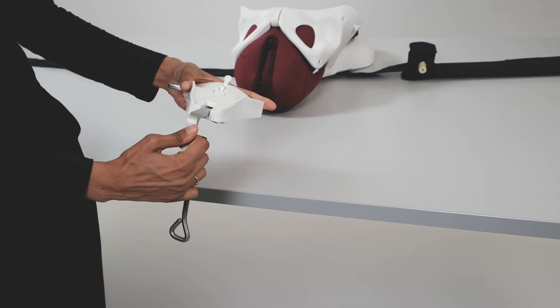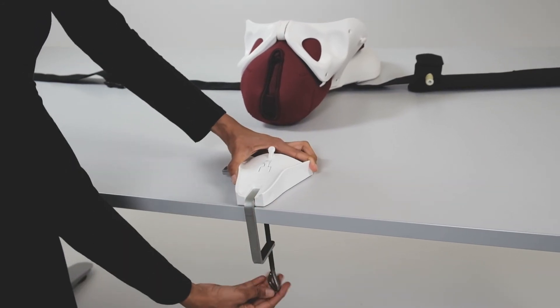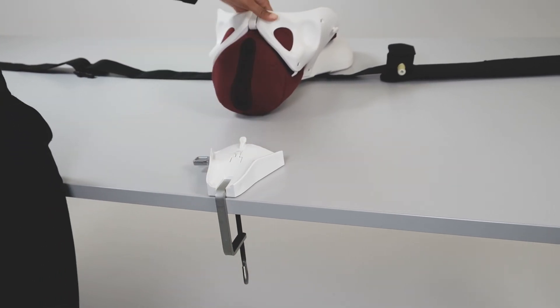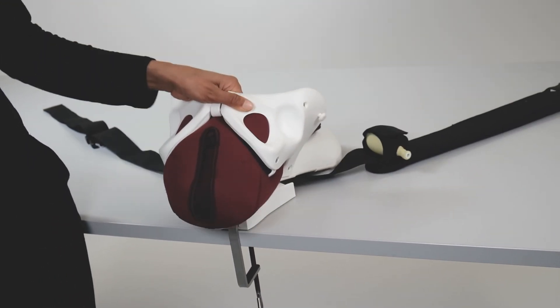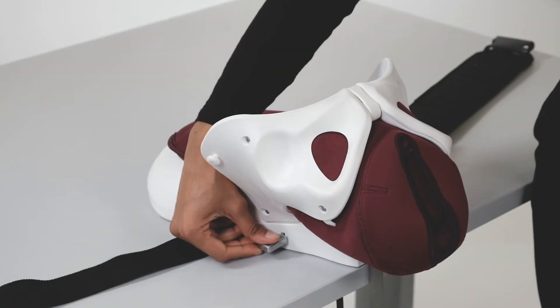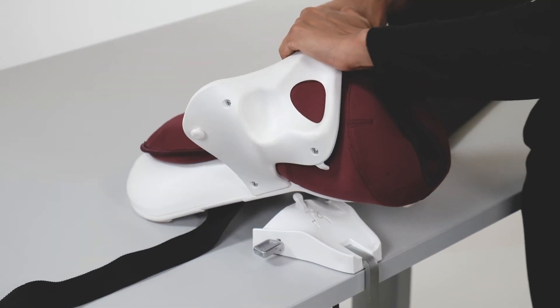Mama Berthy CS can also be mounted on a tabletop during use. Use the table clamp to secure the base plate into position. Slide the pelvis onto the plate. To remove, press the lever on the base of the plate downwards and push the pelvis backward.